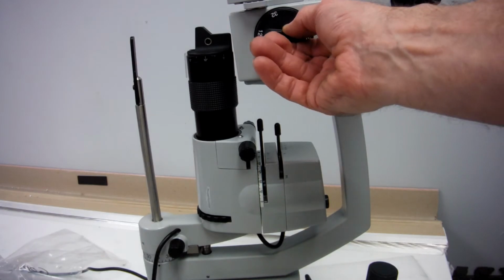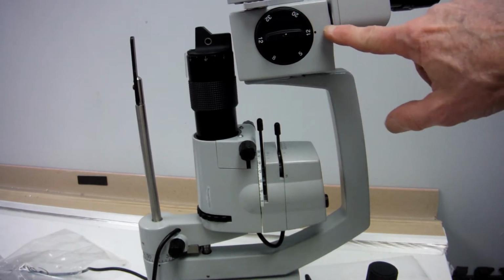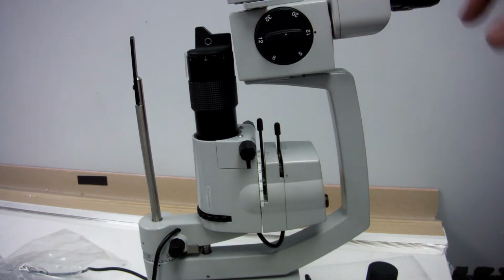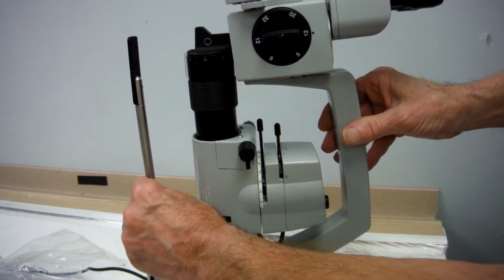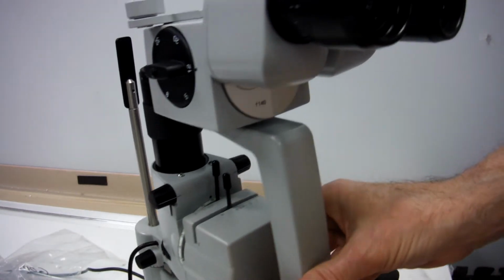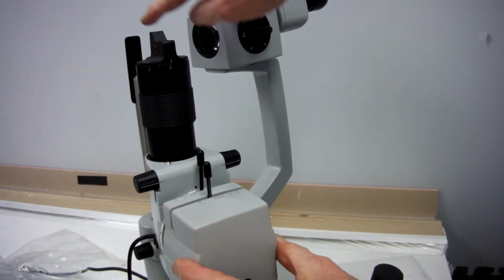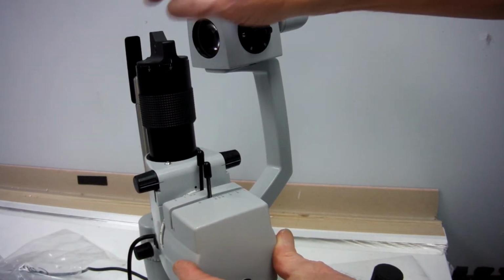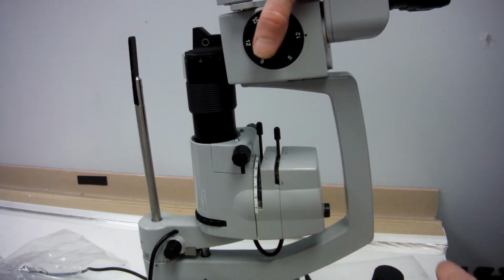When you're looking at it with no magnification, looking through the eyepiece, as you look at your focusing rod, you can look at the space on each side of the focusing rod. If it's even, that means your head is straight.